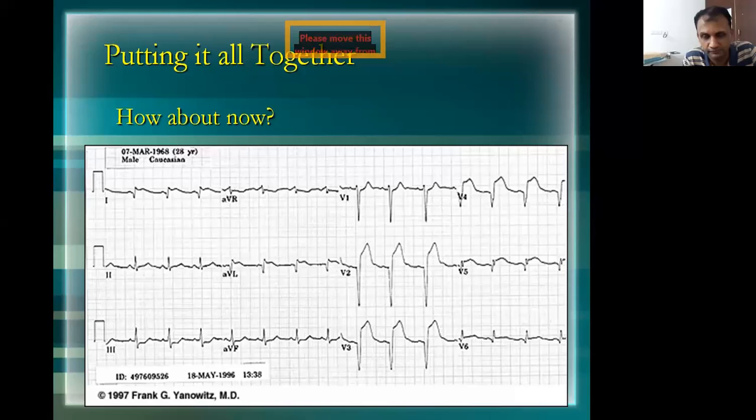AVL, yeah. One interesting thing about ECG in patients having acute MI is when you have an ST segment elevation MI, that's STEMI. For example, if you have it in the anterior wall, then you have what are called reciprocal changes. You might have heard about it. What it means is that opposite to the leads of the anterior wall, you will have ST depression. If you look carefully at the inferior wall here, there's some slight ST depression. Can you see how this is the isoelectric line, but there's a depression there.